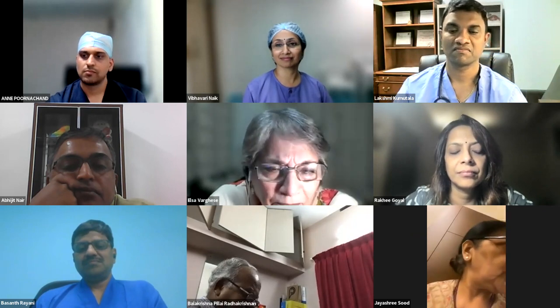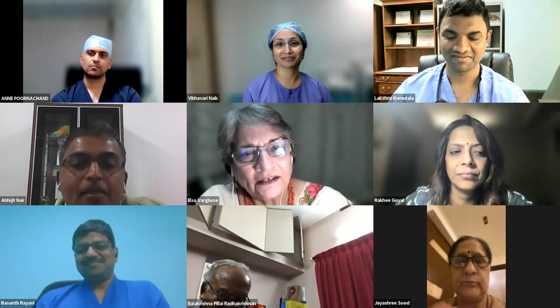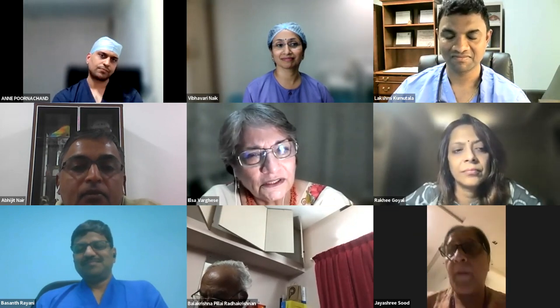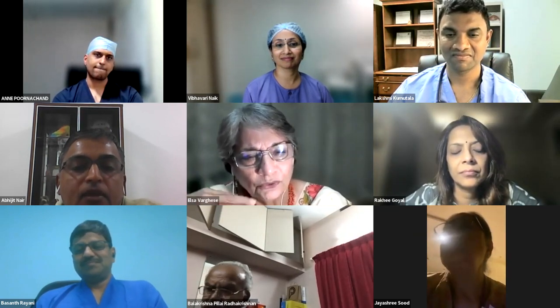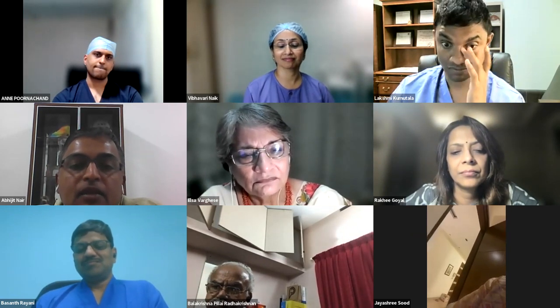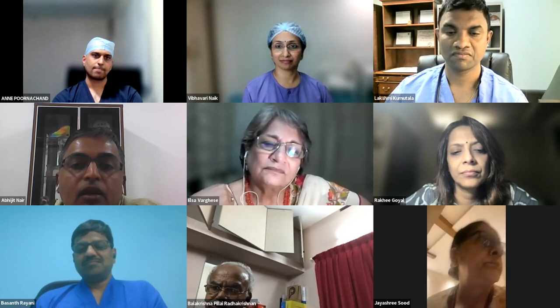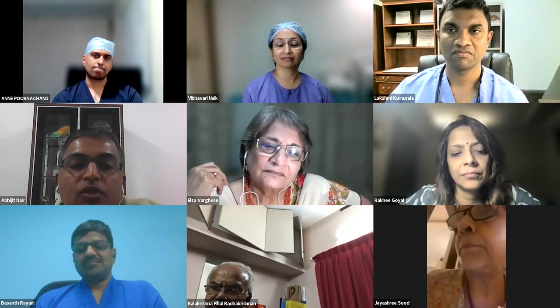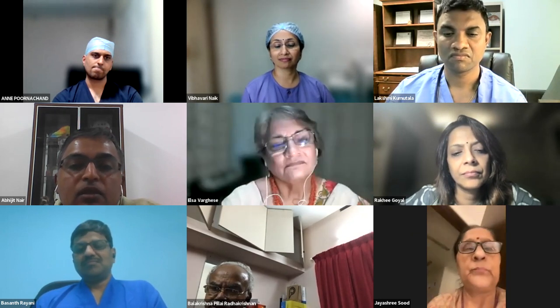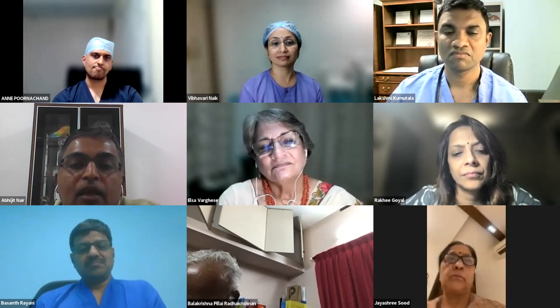I have one more question for Dr. Abhijit. When you said a clean machine, do you recommend that you need to have your monitors on, and make sure that the expired air coming out from the machine has no inhalational agent? How would you know there's no inhalational agent? In certain texts, they have mentioned connecting a test lung, and then accordingly you start ventilation and flush it out. But in most places, they keep the gases on, remove the vaporizers from the stream, and flush it for some really undefined time.